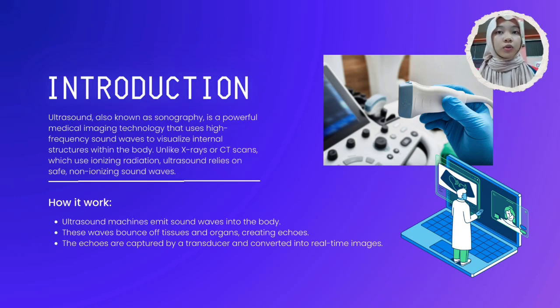Ultrasound waves are produced by a transducer, which can both emit ultrasound waves as well as detect the ultrasound echoes reflected back. In most cases, the active element in an ultrasound transducer is made of special ceramic crystal materials called piezoelectric. These materials are able to produce sound waves when an electric field is applied to them, but can also work in reverse, producing an electric field when a sound wave hits them.